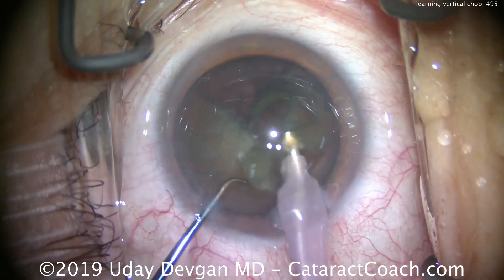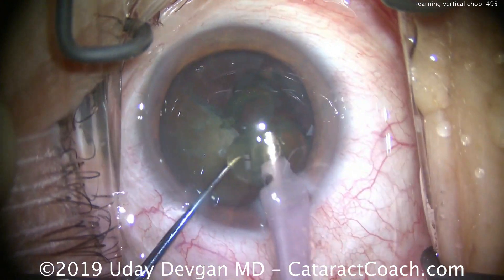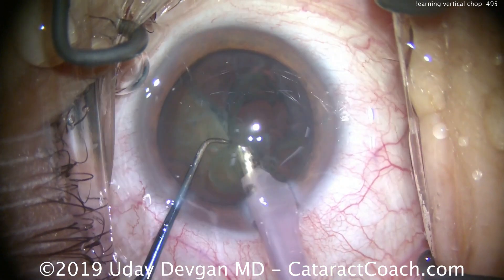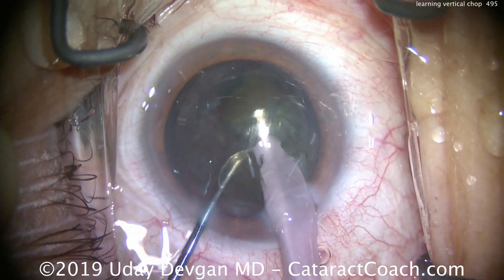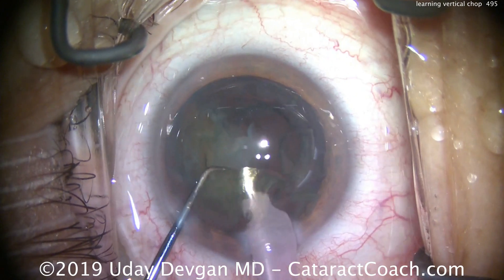Except choppers that have a round ball on the tip, which you'll find very ineffective. You also need a lens nucleus that has sufficient density. If the lens nucleus is butter soft, it's going to be difficult to achieve this — you need some density, 3-plus nuclear sclerosis. With the chopper going around it, you can just sub-chop the pieces and really make short work of the nucleus, as you see in this video.